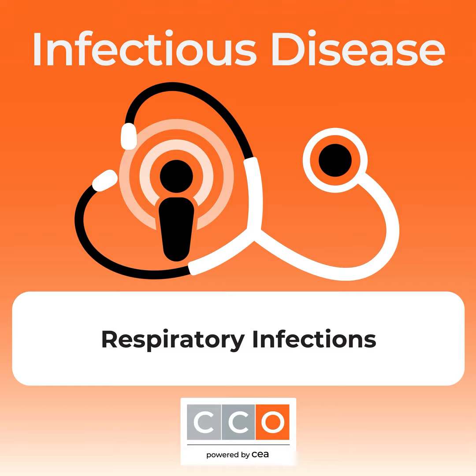And for many of these bacteria, it not only detects what's there, but it also provides a semi-quantitative result, which we'll get into in a minute. It detects common atypical bacteria such as Legionella and Mycoplasma. And importantly, it detects a number of antibiotic resistance genes, whether they're present or absent, and we'll talk about that. And importantly, it not only detects all those bacteria and resistance genes, but it also detects most of the common viruses that can also cause pneumonia, such as influenza, RSV, etc.